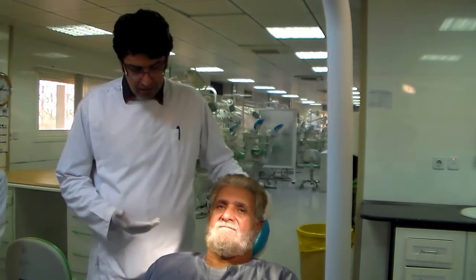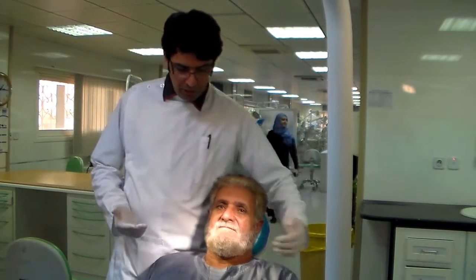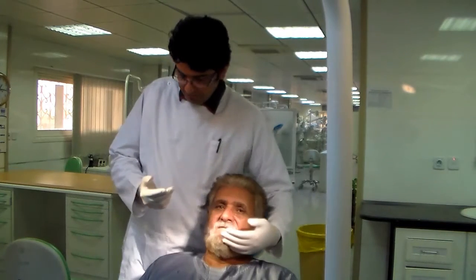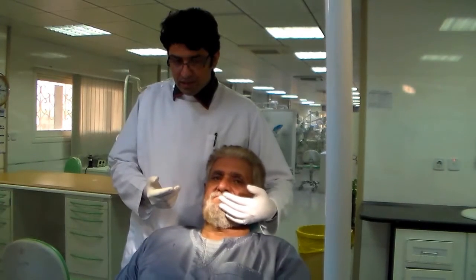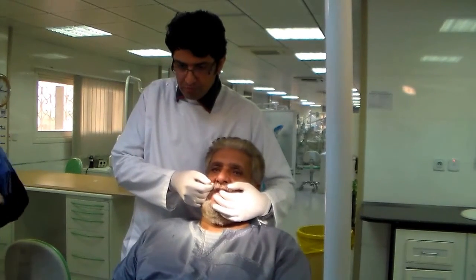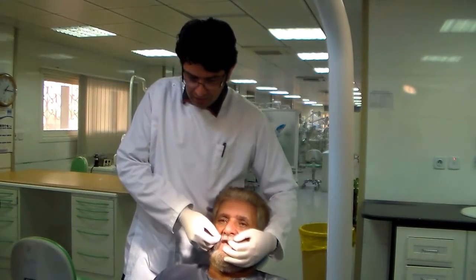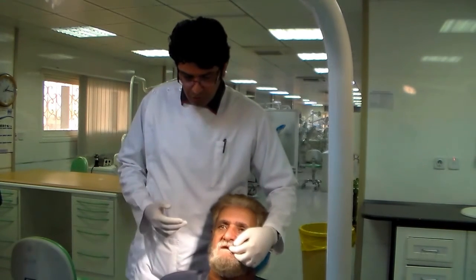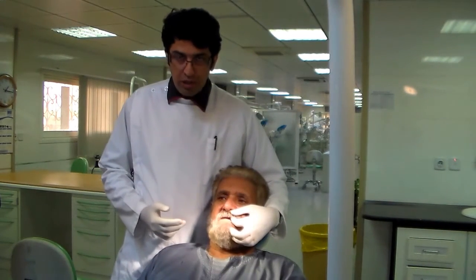For the maxilla, you're going to raise the patient so that his maxilla is at your elbow level, because you're going to be coming around most of the time and using this hand. So it's got to be at the elbow level. If it's way too high, it's going to be a bit difficult for you to do manipulations. If it's way too low, when you put pressure, it's your wrist that's going to be working, not your elbows. So you want to put him at a height where his head is around the height of your elbow.